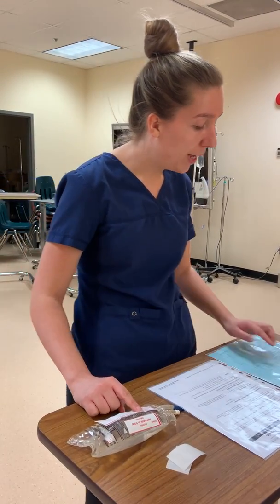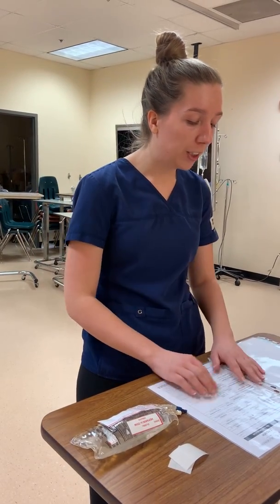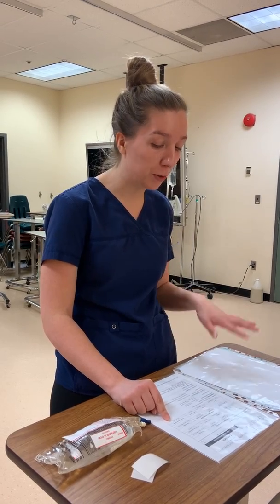I have the right medication. They're to receive 1350 units an hour. According to the monograph, I'll need to find a pre-mixed bag of 25,000 units, diluent of 250 ml, final volume of 250 ml, and a final concentration of 100 units per ml to give this prescribed dose.